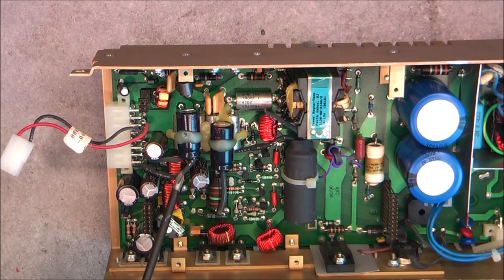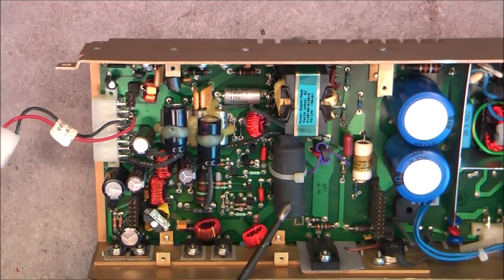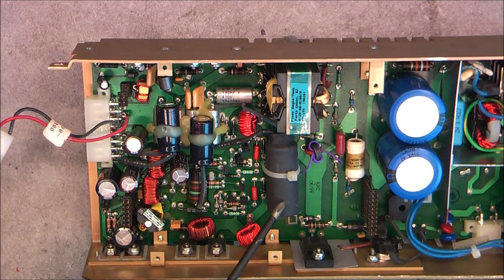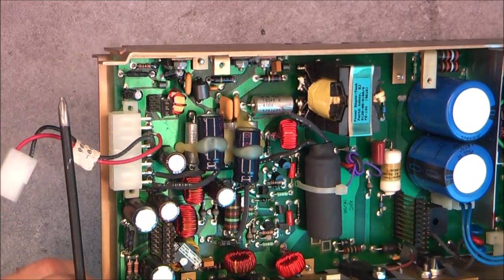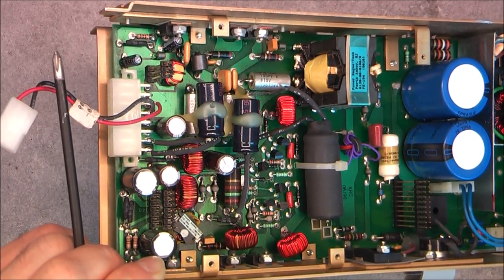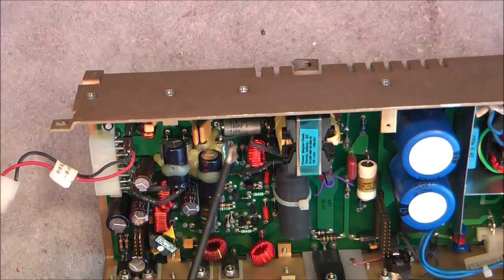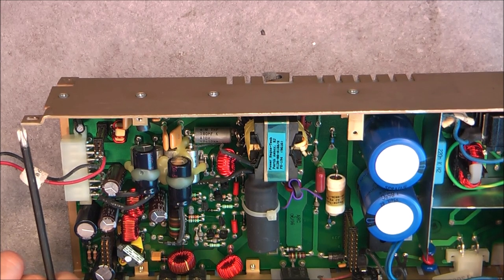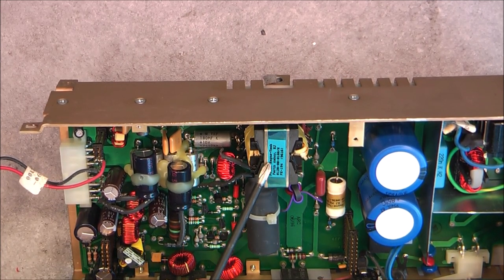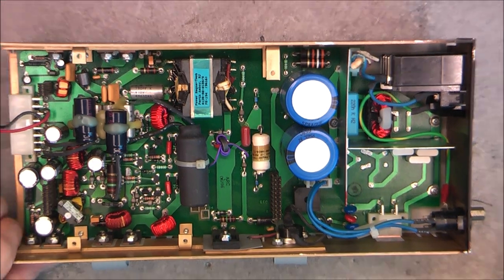And it looks like in the heat shrink here they did also add a resistor. We have the same thing here in parallel with this big resistor. And apparently one more here in heat shrink with a zip tie. I do not know if the holes for the zip ties are original or not. They do not seem terribly clean on the edge. So it must be a modification, this thing. Again a resistor in series and connected again in parallel with this capacitor. Quite interesting. The transformer is made by Power Magnetech in Perth Amboy, New Jersey. And yes, it is a US made device, made in America.